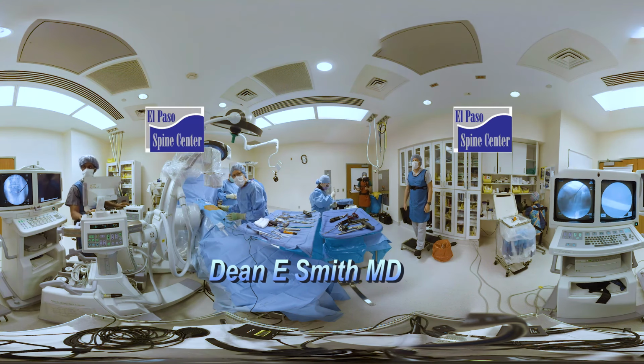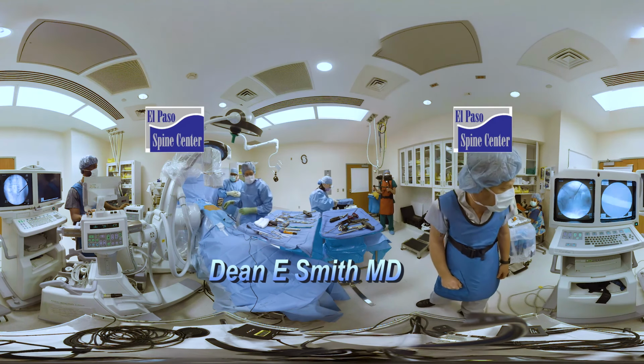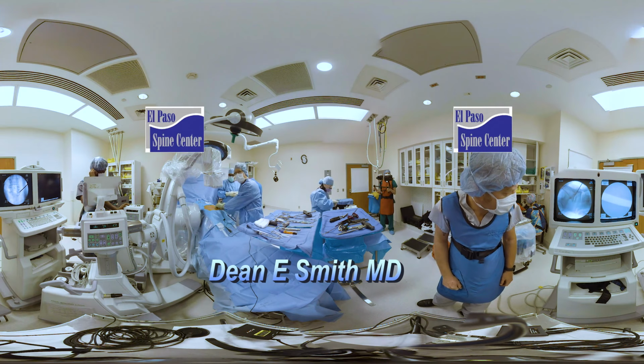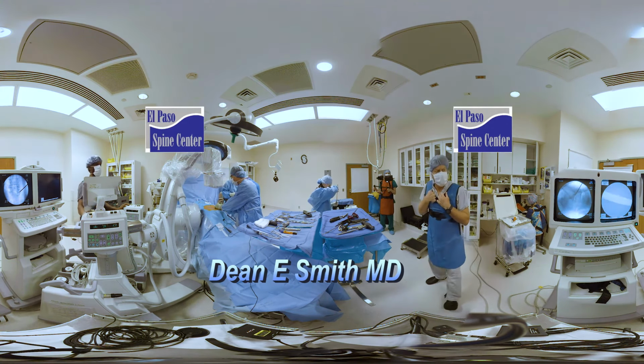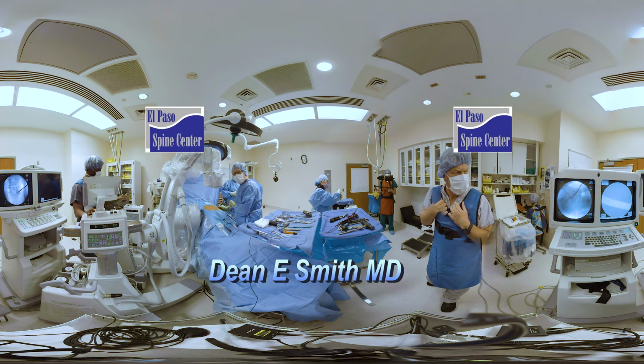Lateral, please. AP, I think that looks like a pretty good spot. Connect the probe. Let's see if I can medialize it a little bit. I don't think so. AP, lateral.